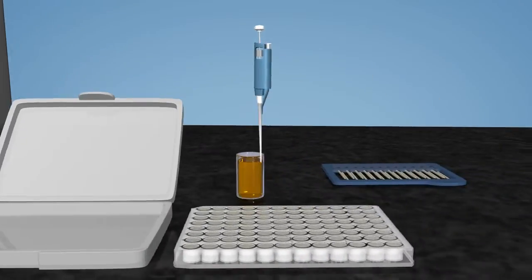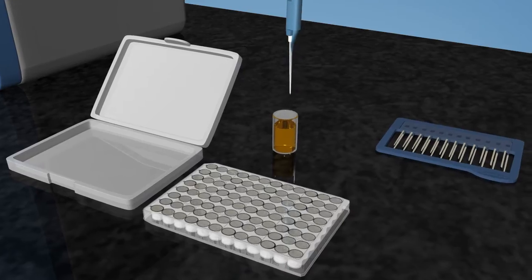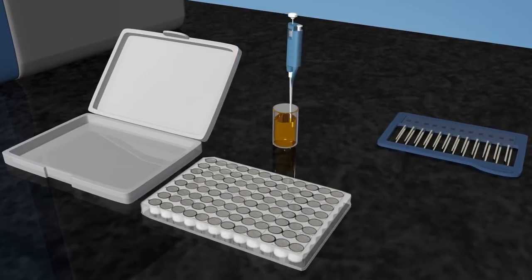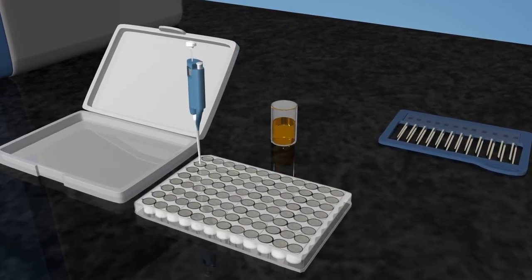To run an assay, the user simply adds their sample to a pre-filled reagent plate and loads that plate along with the auto array into the Maverick instrument.